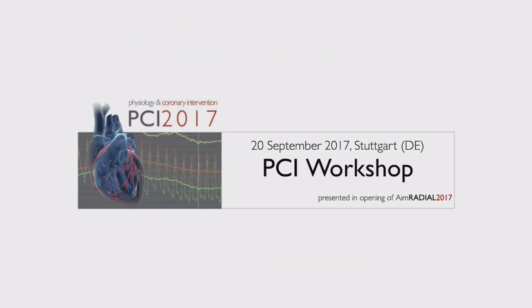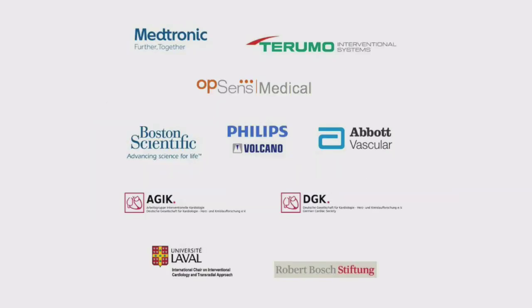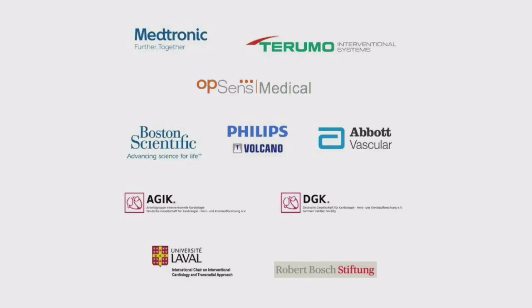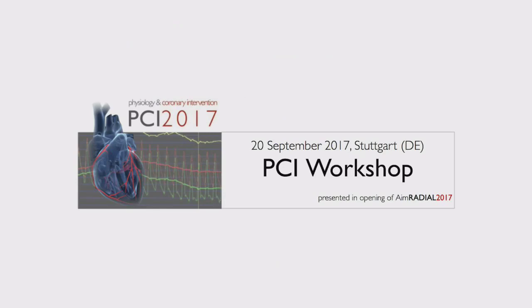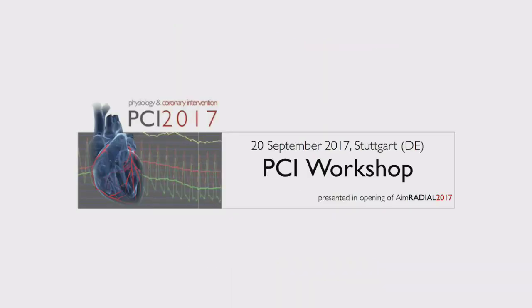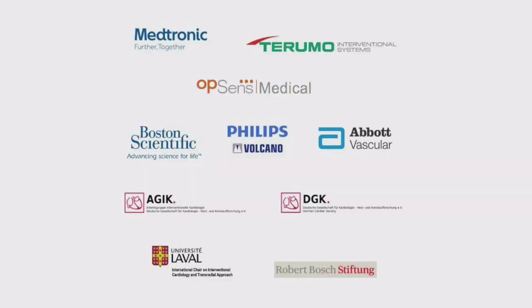It's a very good question. I think it's the ischemic burden that we could have in those patients. What we have seen in all the data previously published, also on the FAME trial, is that the FFR post-stenting could be considered not as a binary value, but as a continuous value reflecting the atherosclerotic burden that we leave in the coronary.